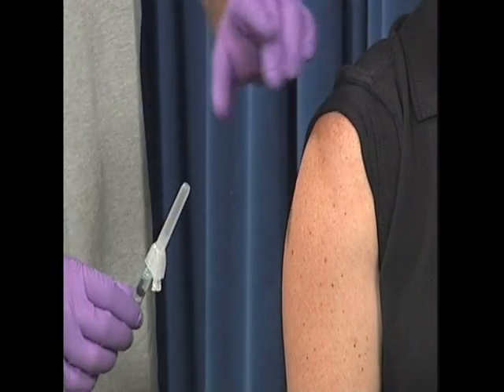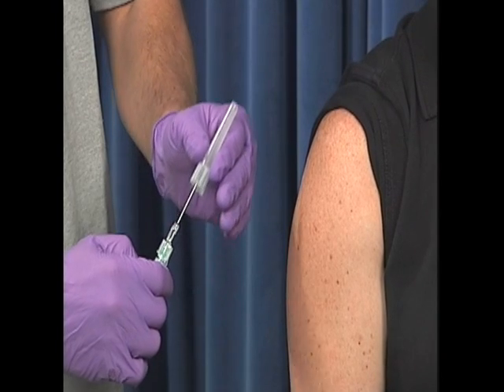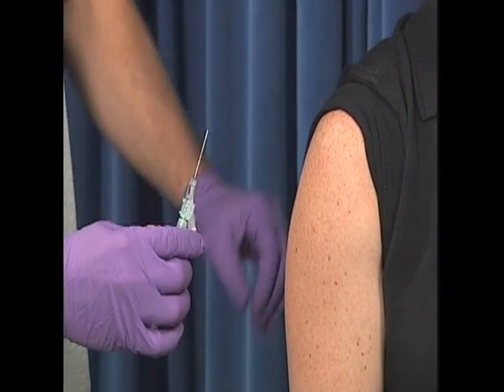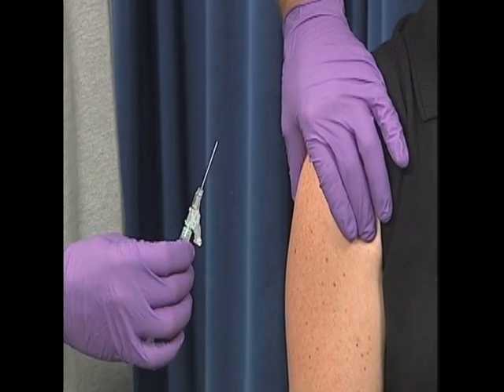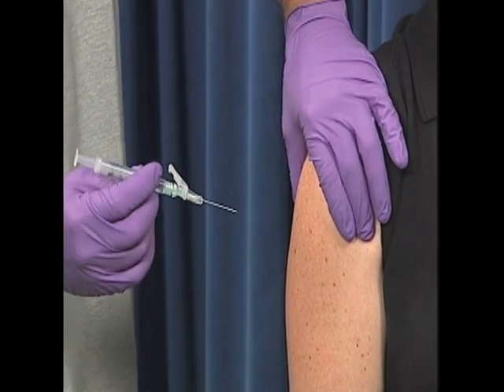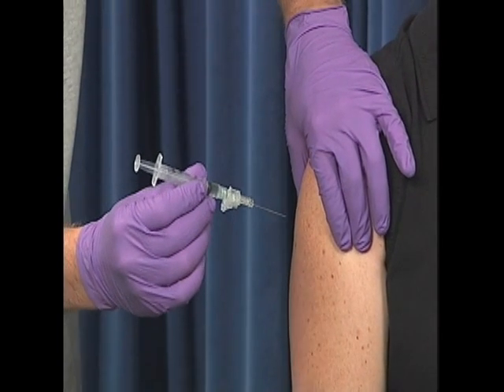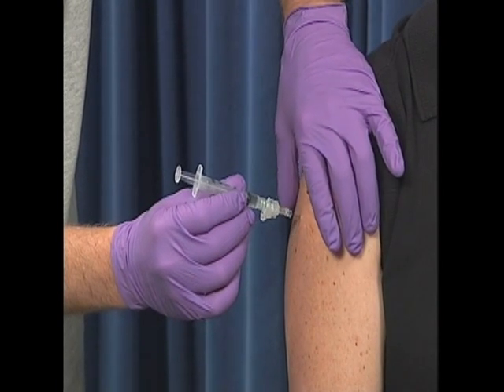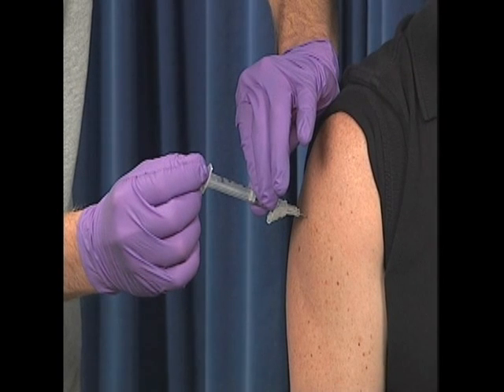Hold the syringe in your dominant hand and remove the needle cover. Stabilize the injection site with your non-dominant hand using either the pinch technique or the stretch technique. Tell the patient they will feel a poke and, holding the syringe like a dart, quickly but not forcefully insert the needle at a 90-degree angle until the proper depth is reached. Release the skin while continuing to hold the syringe in place with the dominant hand.